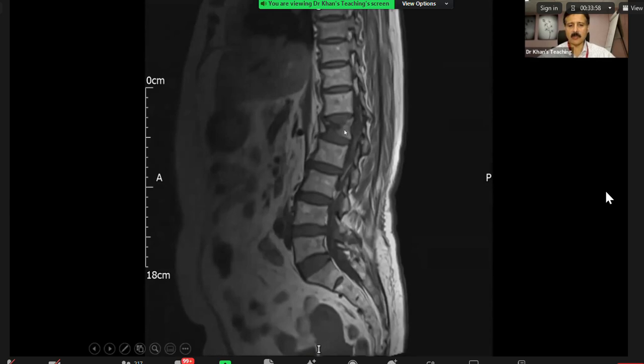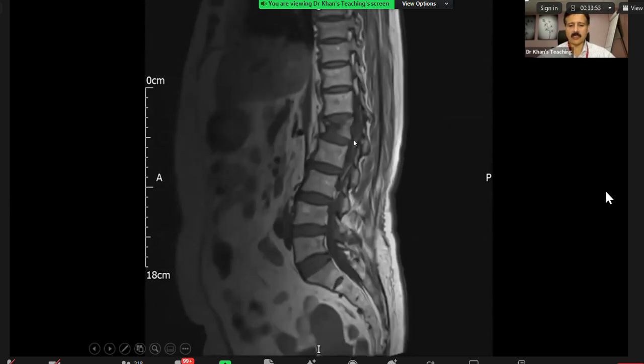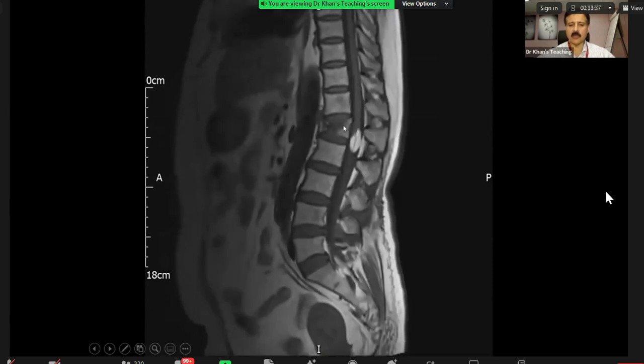Please remember that there is no fracture line in a metastatic fracture. Number two, is there a bulge on the posterior surface? If there is metastasis of something, there might be a bulge. Is the intervertebral disc next to it showing a biconvex appearance like this? So this is osteoporosis, and with this, a trivial trauma caused all this fracture.